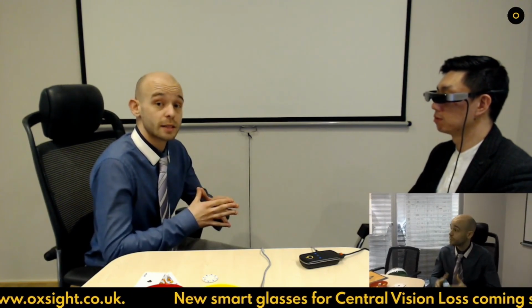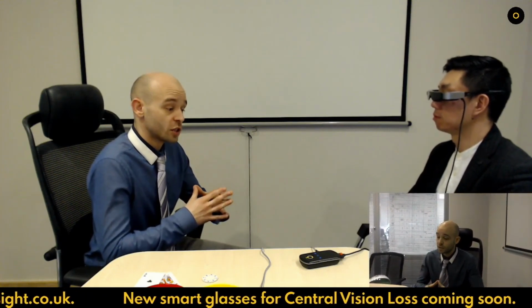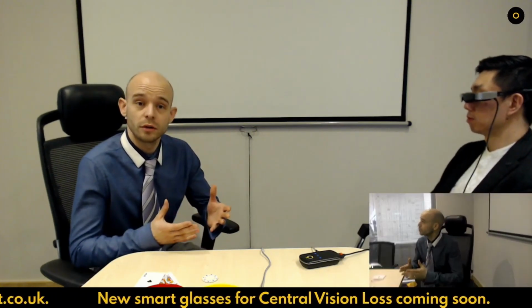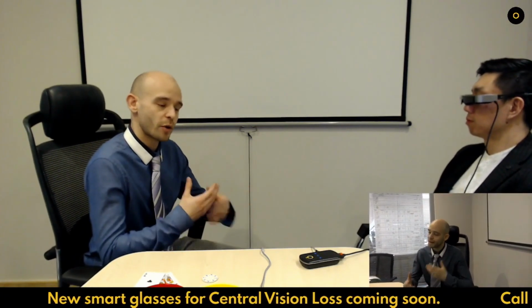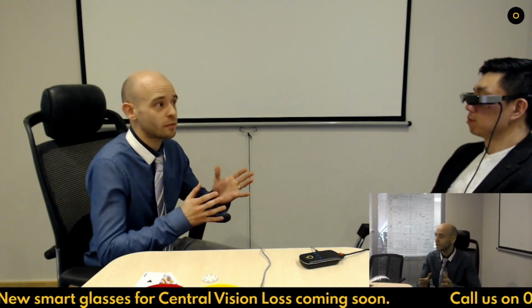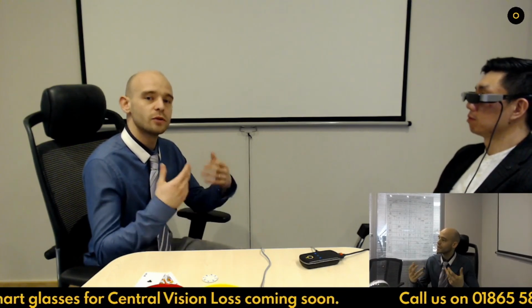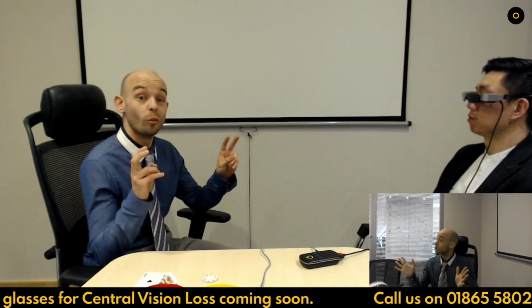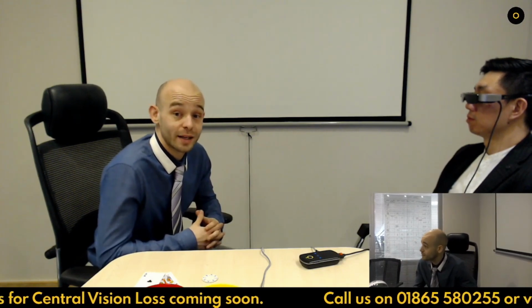One of the first things a lot of the time people will say to me is, feels like I'm looking at TV screens, which is essentially not wrong. You are looking at screens and the image you're looking at is different, so the brain has to process these things a little bit. So it normally takes about 5 to 10 minutes before the brain starts to accept the image it's looking at, and it feels a little bit more what we call normal as such. But it does subside quite quickly.